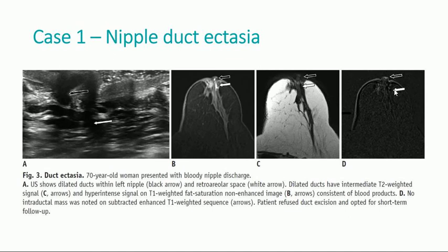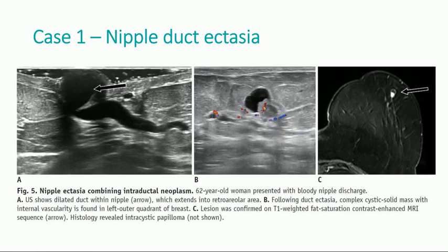No intraductal mass was noted on subtractive post-enhanced T1-weighted sequence. We need to be careful because in some cases of nipple duct ectasia, we might find an intraductal mass, such as in this case of intracystic papilloma highlighted also on the MRI.